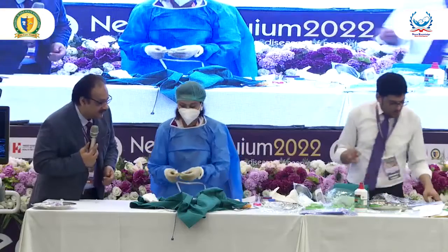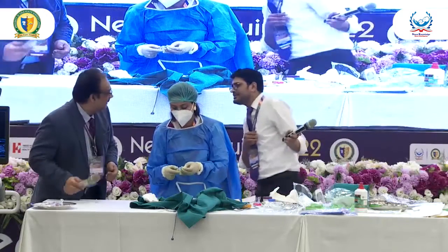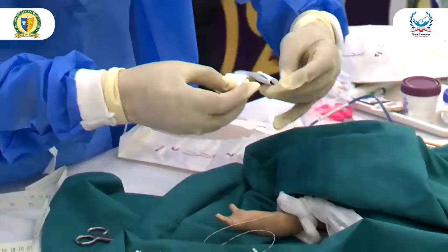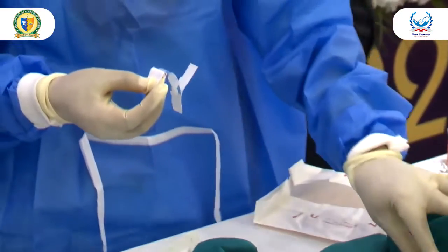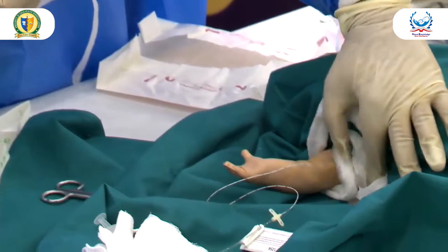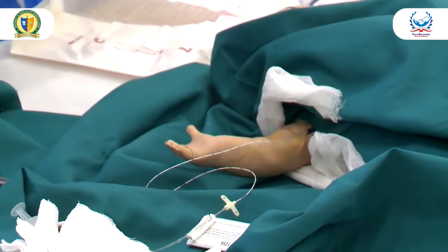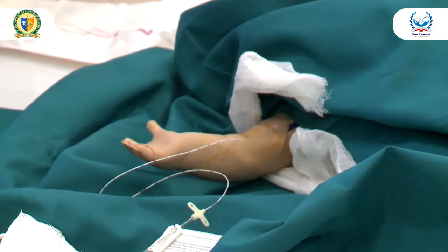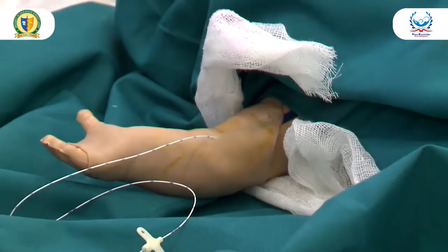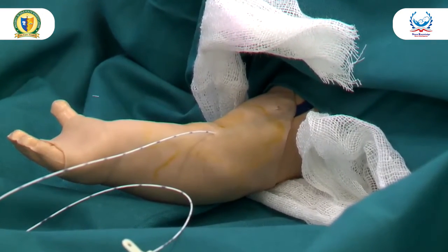At this point, remember Dr. Irfan talked about this: you have to put a sterile strip here and leave the baby until you confirm the position.